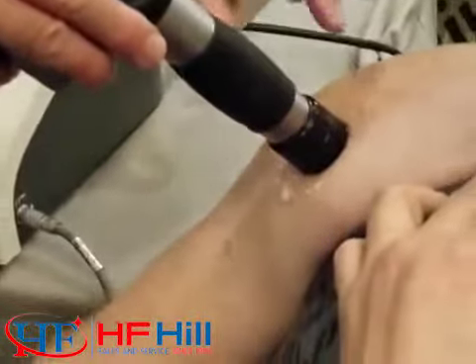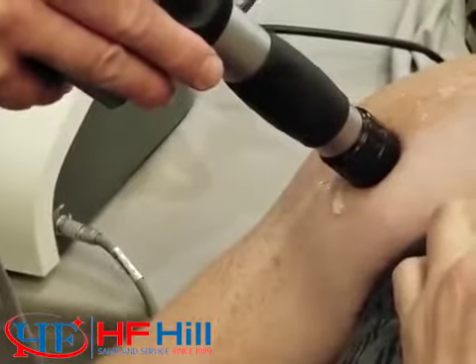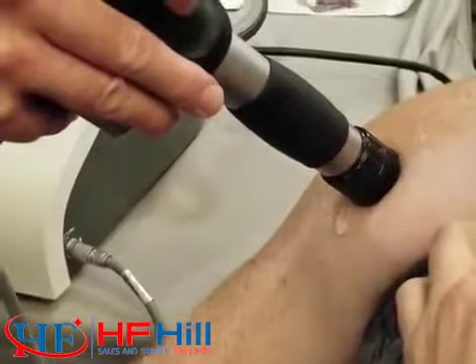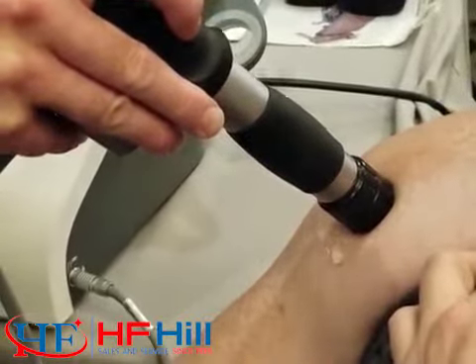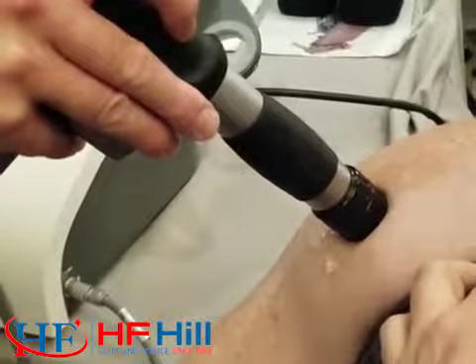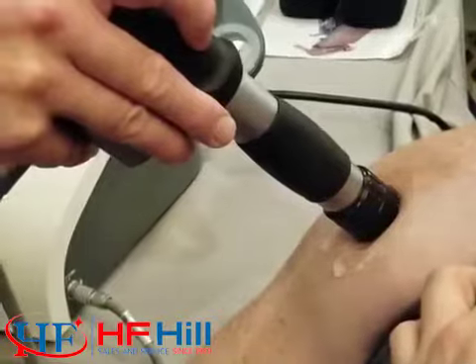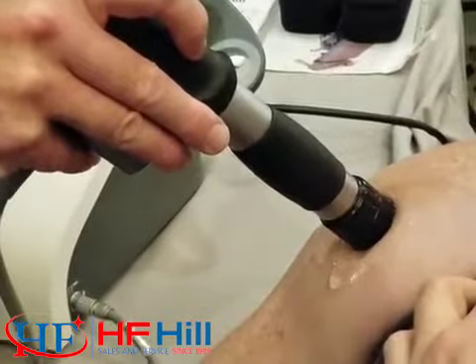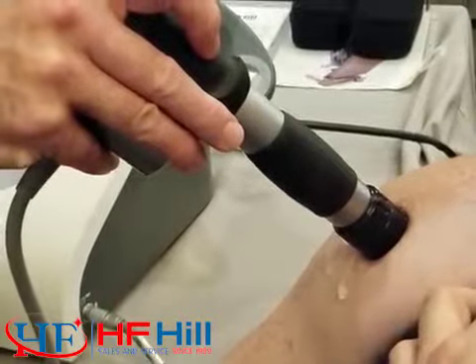It's not moving like with ultrasound. So really, what we want to do is make sure that you're perpendicular to the tissue. I don't have to press in there because of the pressure exertion. I just want to be in full contact because the transfer of energy is going to be acoustic. So pressing in there with a very, very firm hold doesn't necessarily make it much different. We do want it to be in good contact, and that's where the transmission of energy is going to occur.